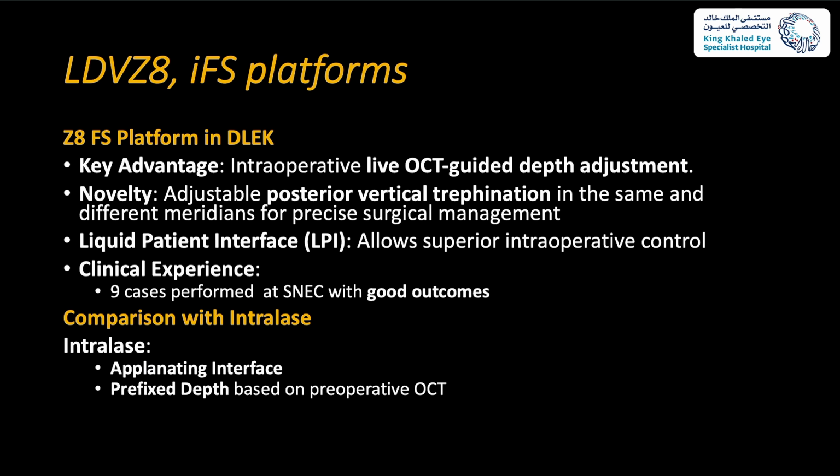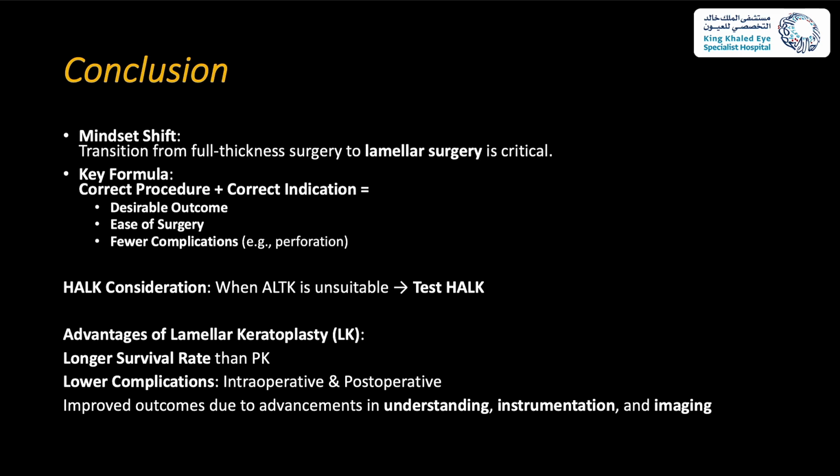So basically, what's the difference between our paper and Bruce Allan's paper? Here we are using intraoperative live OCT guided depth adjustment. You can adjust the posterior vertical trephination at different areas and different meridians. We are using a liquid patient interface, so you're not applanating the cornea. And the clinical experience until now is good; 9 cases were done. However, the other paper used an applanating interface, and you cannot adjust anything. You base all your judgment on the pre-fixed depth from your preoperative OCT.